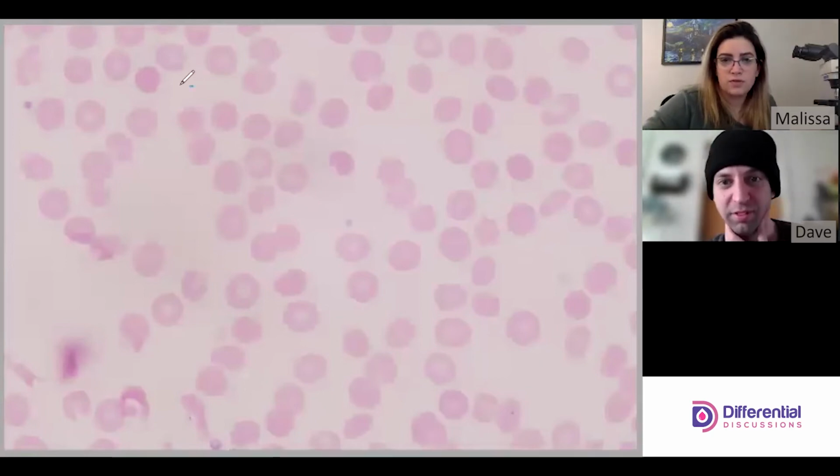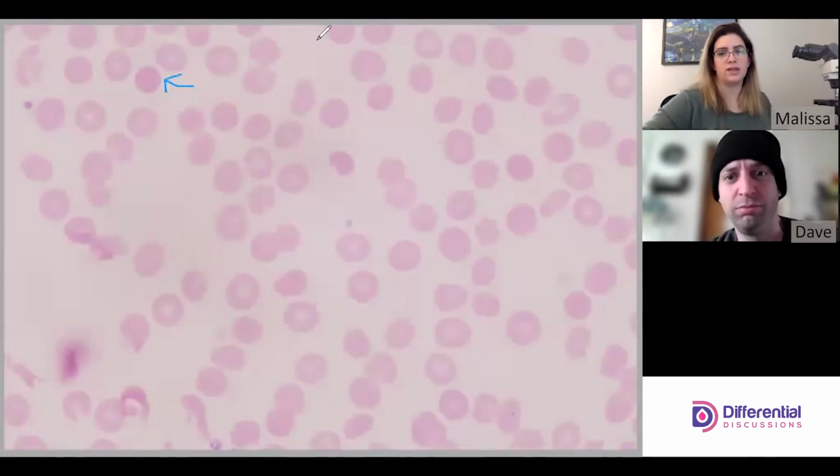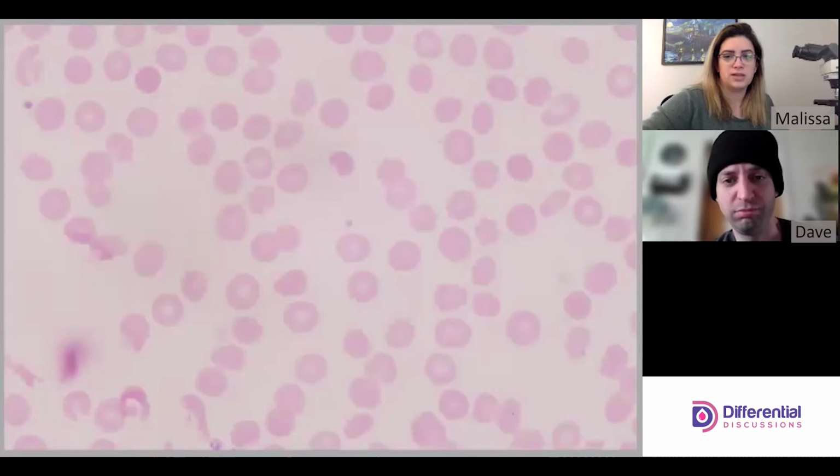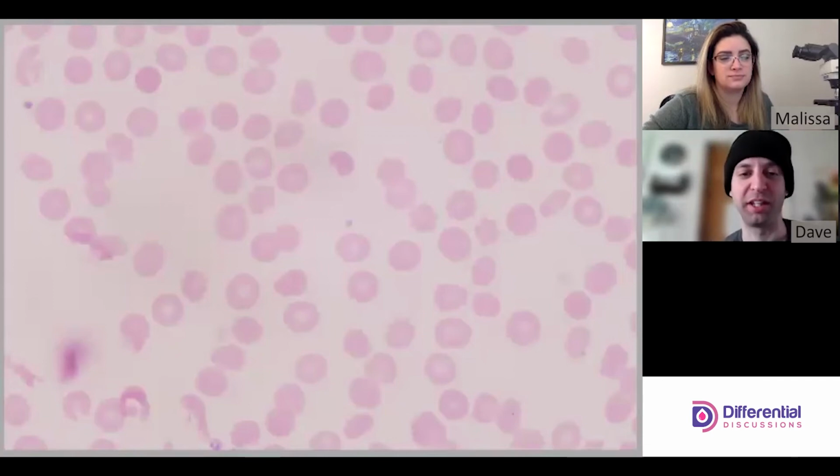Yep. A few spherocytes. Yeah, I see a couple on this field. Yeah, yep. Me too. I don't think that we are thin enough that it's the artifact spherocytes. They look like real spherocytes. Mm-hmm. And honestly, that's something that just comes with time and practice. It is. I could not describe to you how I know it if my life depended on it. But there's something about the red cells where they look content to me. These look content.